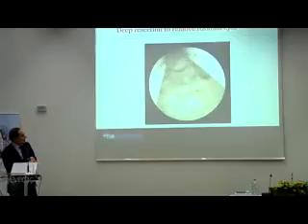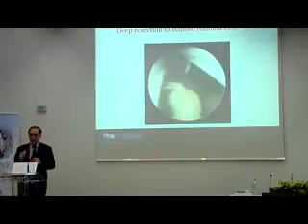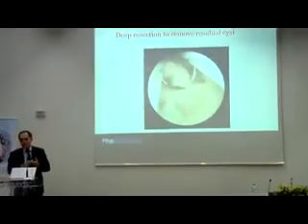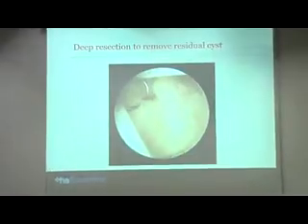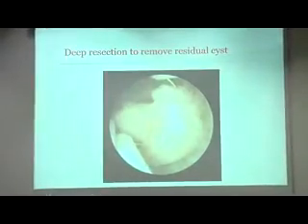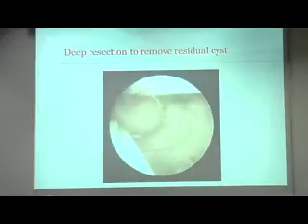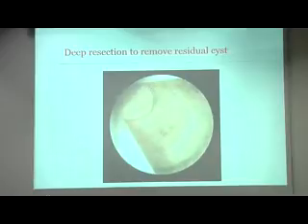Let's go and look. And this is the advantage of hysteroscopy. You see exactly if it is okay. You can recognize, but if the whole muscle is diseased, then you have a problem. So check. Your safety zones should always be 5 millimeter, and here you will see that here is something which is a little bit, so we coagulate.